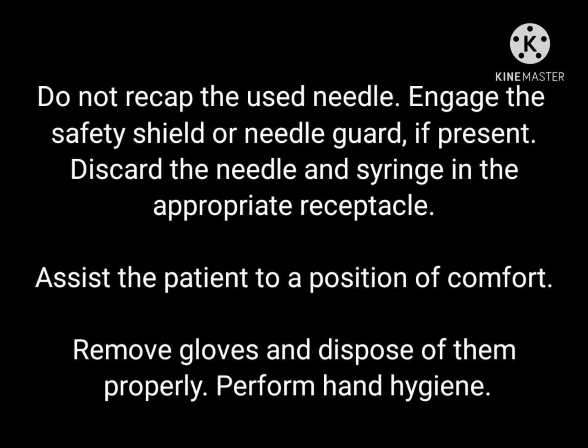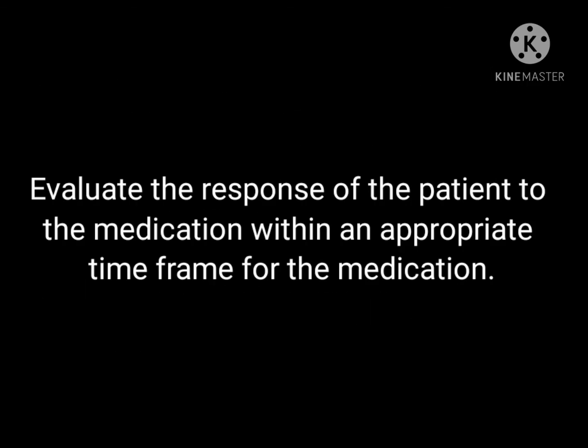Assist the patient to a position of comfort. Remove gloves and dispose them properly, and then perform hand hygiene. Evaluate the patient's response to the medication within an appropriate time frame for the medication. Then finally, document the procedure in the patient's chart.